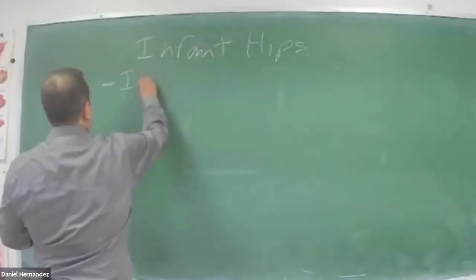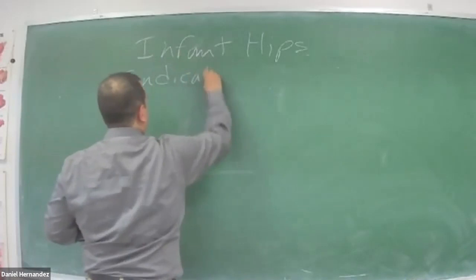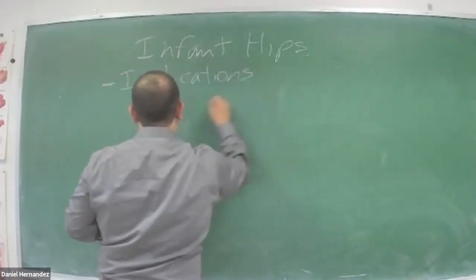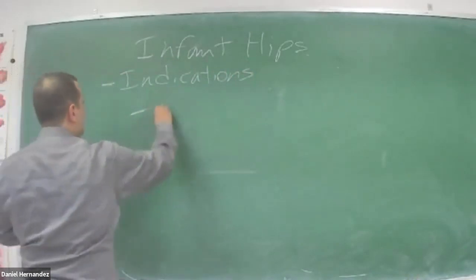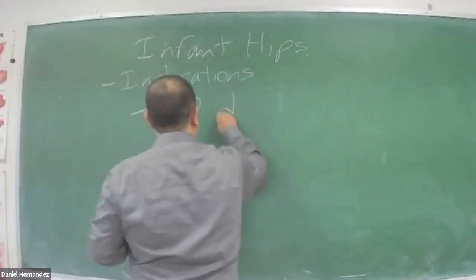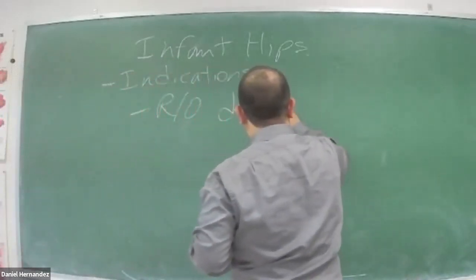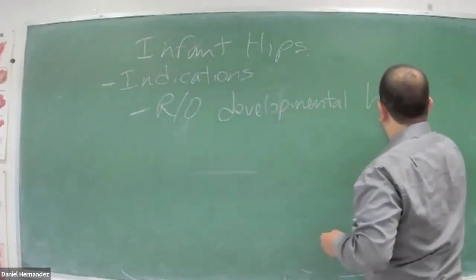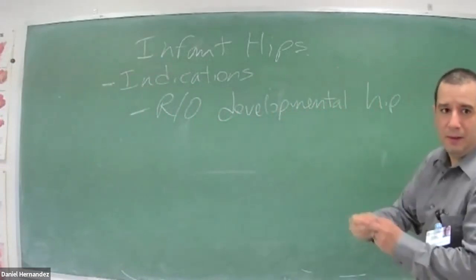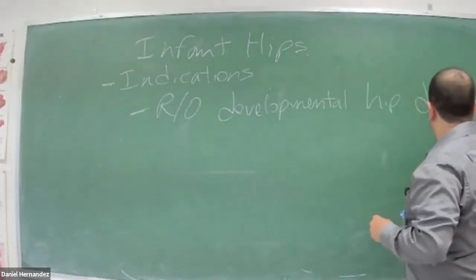So, infant hip, indication. We're going to rule out developmental hip dysplasia.